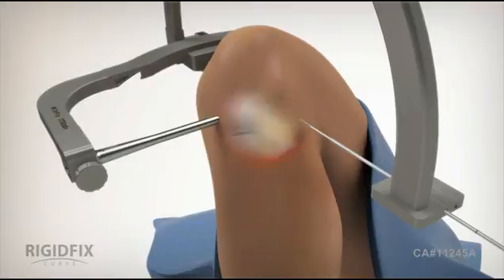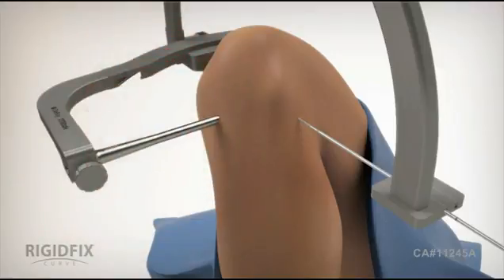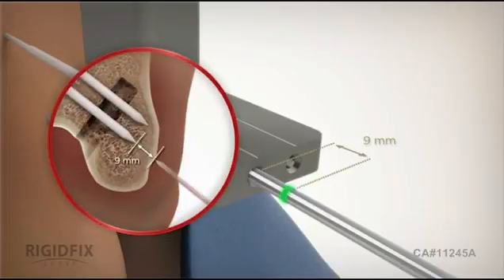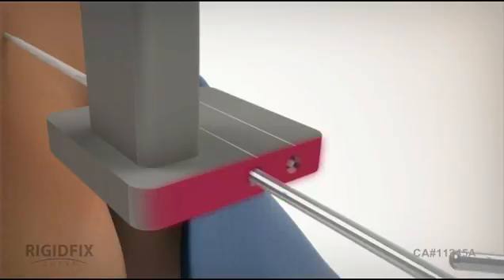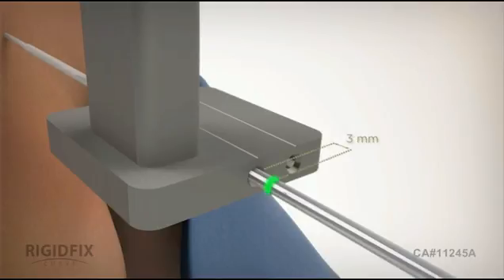Insert the bone gauge pin through the arc hole so that it penetrates the patient's skin and maintains contact with the lateral femoral cortex. Then look for the laser line on the bone gauge pin. This line indicates that there is sufficient lateral bone stock. The distance between the back of the laser line and the arc surface equals the measurement of lateral bone stock. If the laser line is not visible, then slightly adjust the block or rotate the frame about the tunnel axis, but make sure the block maintains a position anterior to the medial epicondyle. Then recheck the lateral bone stock with the bone gauge pin and, if acceptable, mark the new entry location on the patient's skin and continue with the procedure.